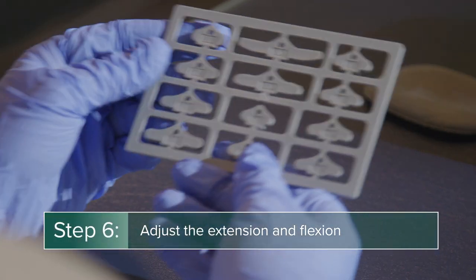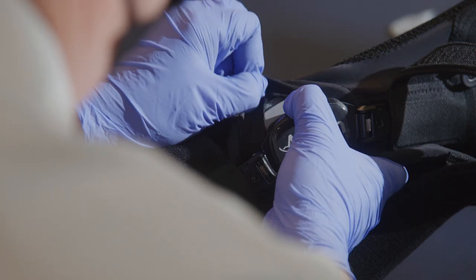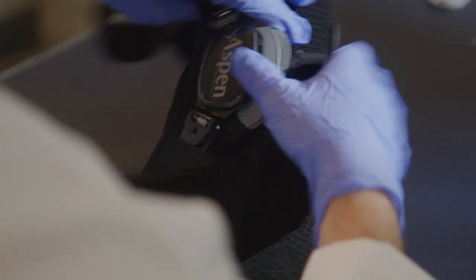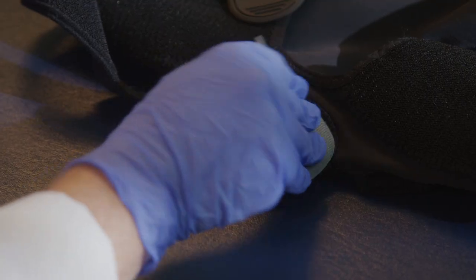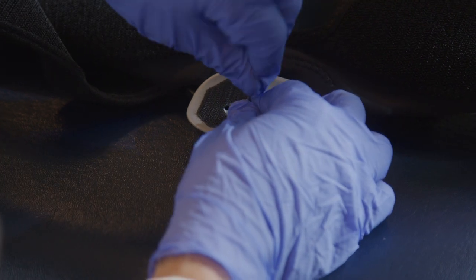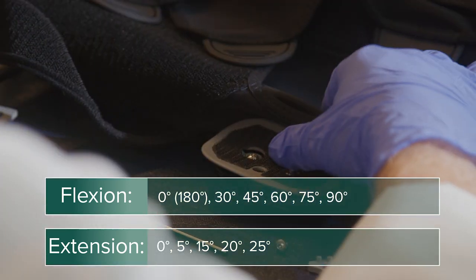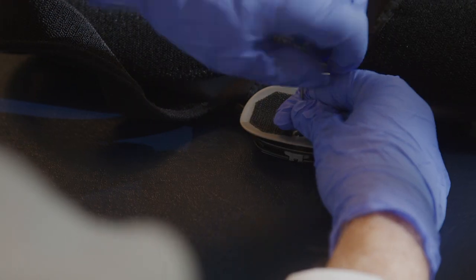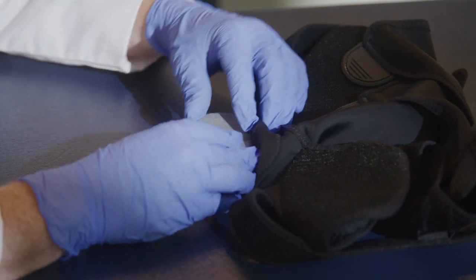Clinicians can also determine if flexion and extension limits need to be set. To adjust the range of motion, remove the condyle pad by sliding it out of the wrap material and removing the screw for the limit stop. Remove the limit stop from the hinge and insert the required angular degree from the kit included with the brace. Secure the inserted limit stop with the screw and reinsert the pad into the condyle pocket.